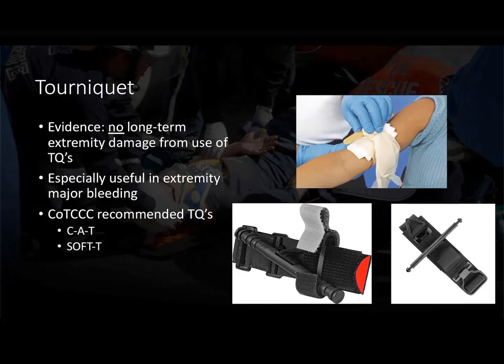The study evaluated casualties that had extremity injuries and had tourniquets applied in the field. In some cases, these patients had tourniquets on for a number of hours before it was released during the patient's surgery. They found that there were no long-term negative effects on the patient's extremity just by applying the tourniquet, including no instances of long-term neurological deficit. So that means that tourniquets are going to be a very valuable part of our bleeding control and management.